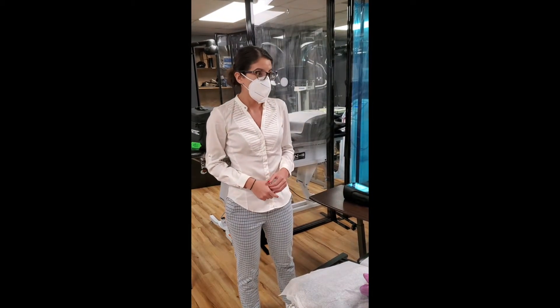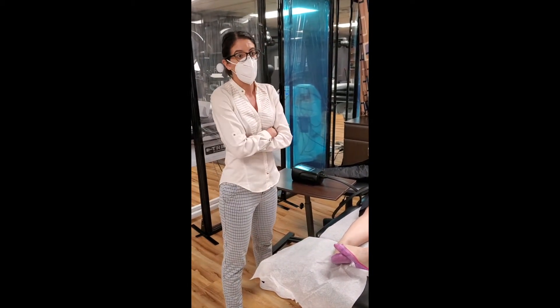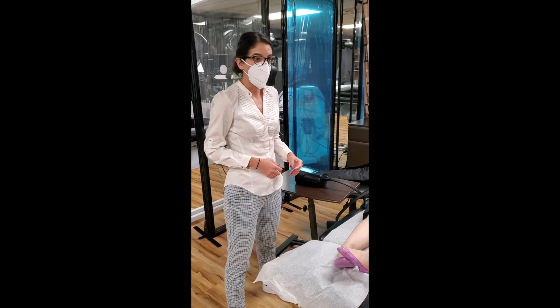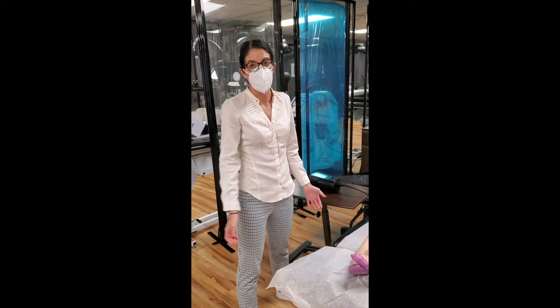We got this upper extremity unit because we started seeing more patients post breast cancer, esophageal cancer, or throat cancer who had radiation treatment and ended up developing inflammation in their upper extremities.